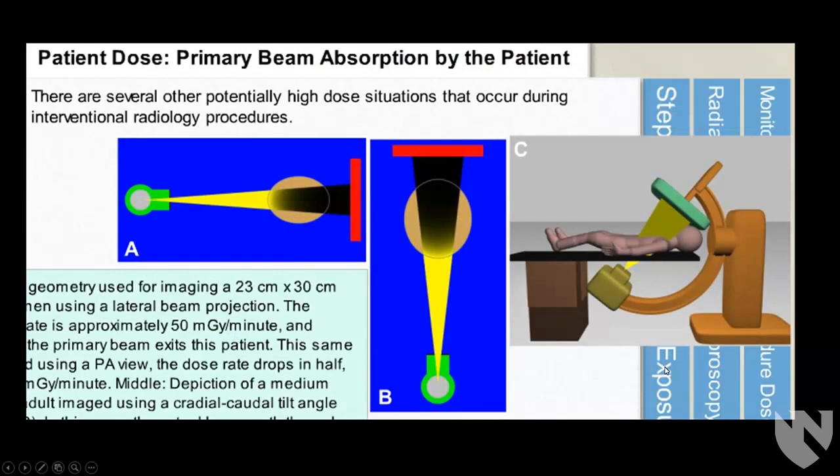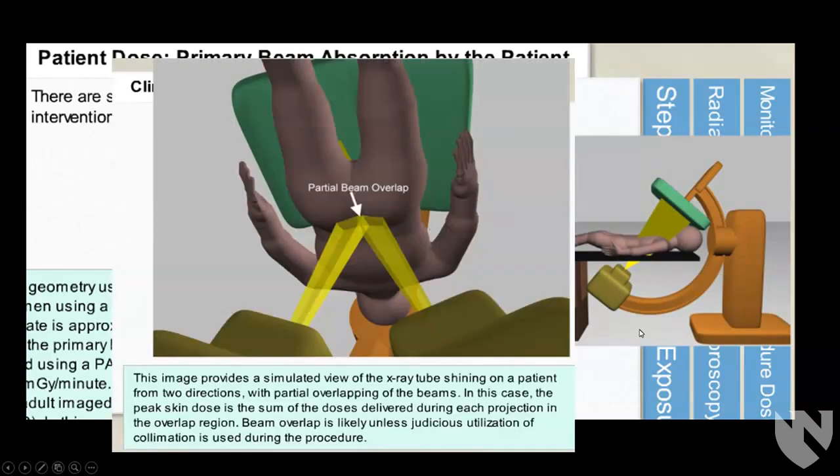there are ways that you can reduce the thickness. If you need to image a patient, you can try to image them through the thinner part instead of the thicker part, so like in the abdomen, anterior to posterior rather than going transverse. If you can do that and get your images, that'll help. Also, try to not do things like this, where you're obliquing through the patient, so the overall thickness that the machine sees is going to be more. Whereas if you could do a straight AP here, there would be less thickness and so less dose.